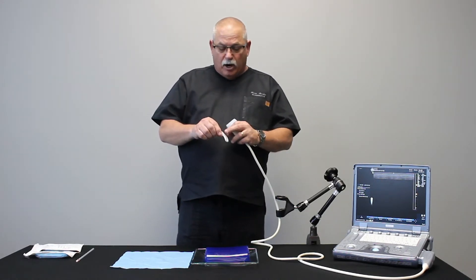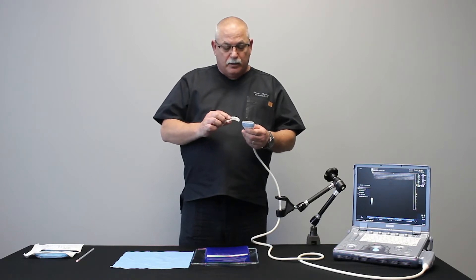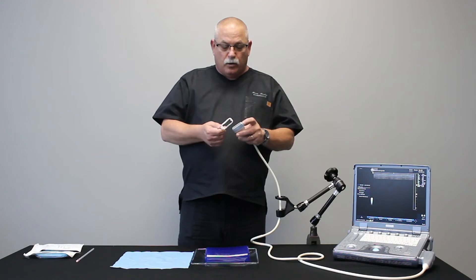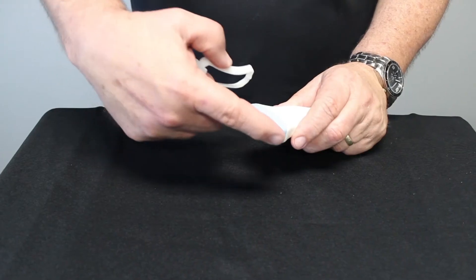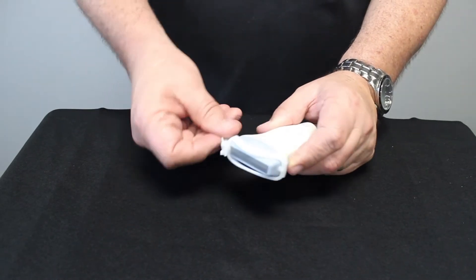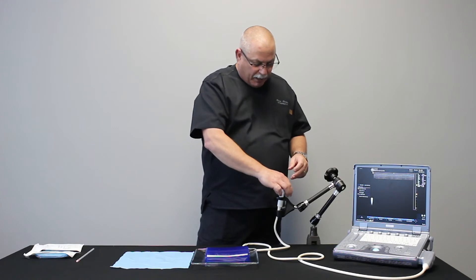Now inside the bracket are some locating features that you'll also find on the transducer, so there's only one way it fits and only one way it'll go on. Identify those locating features, line them up, and when you put the bracket on you'll hear a bit of a snap or a pop when it's on correctly. I'm going to put that back in my holder for now.